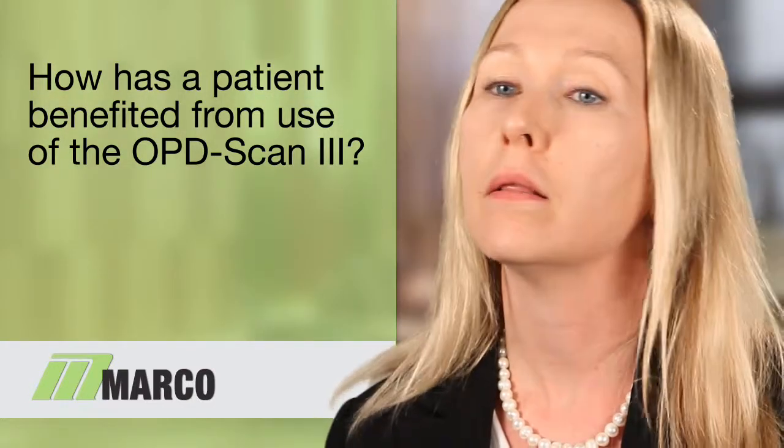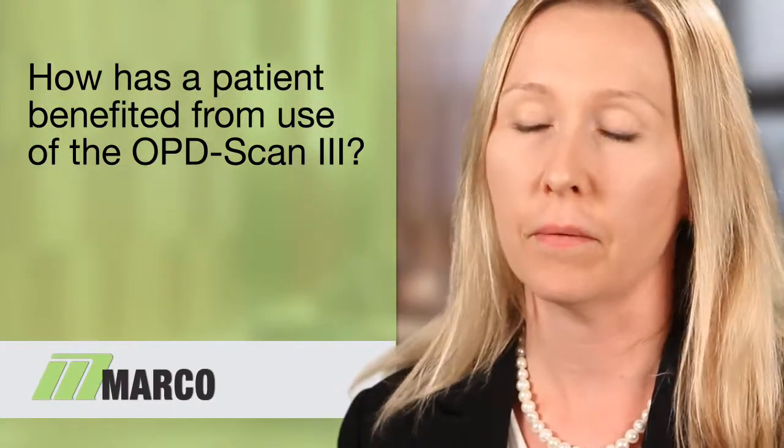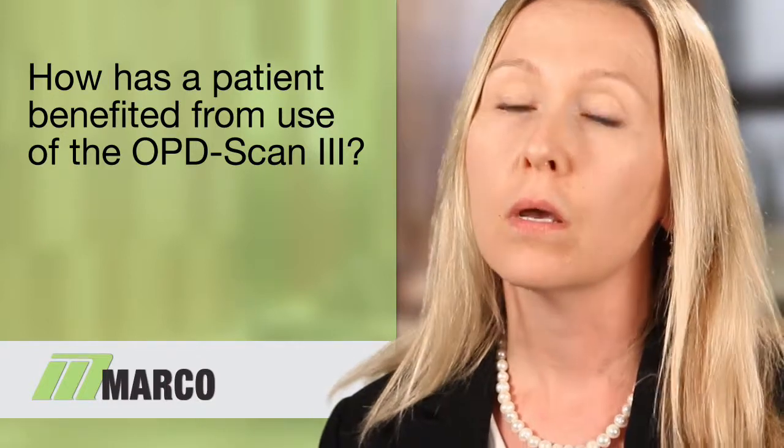So we went back and started looking at what could be the cause. We looked at the posterior chamber implant, and it was clear with a minimal posterior capsular fibrosis. And we also looked at the cornea, and everything was fine. So we went back to the OPD. We noticed his preoperative measurements were very normal. His cornea was clear.